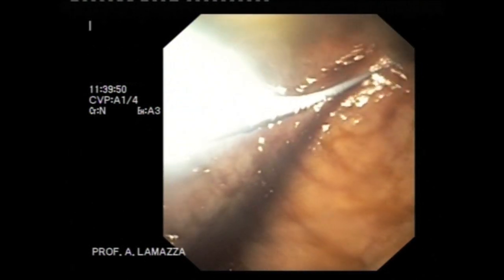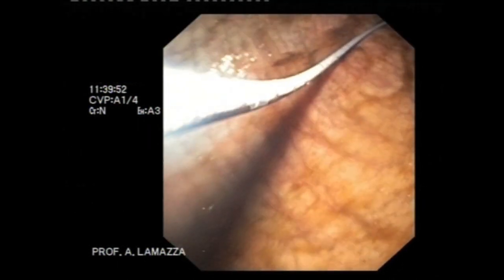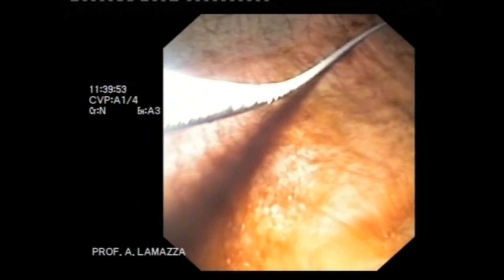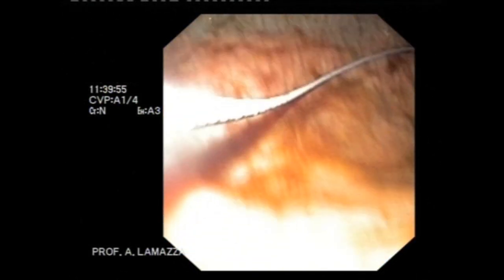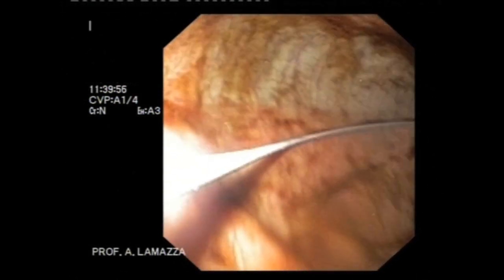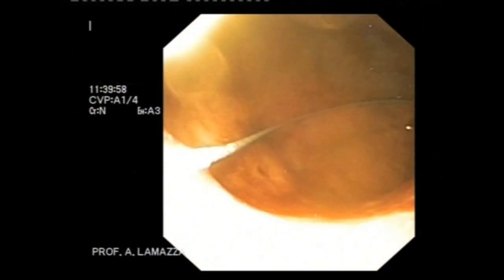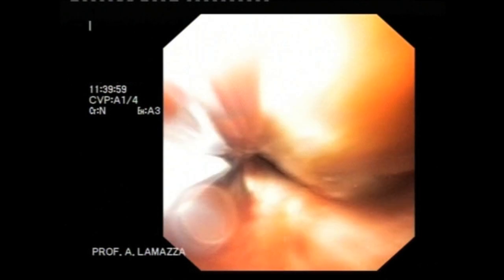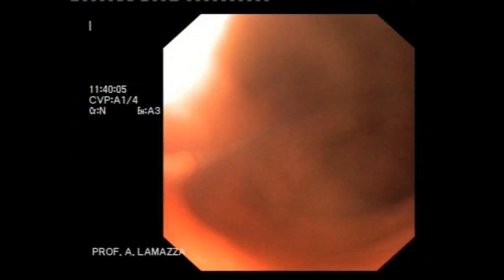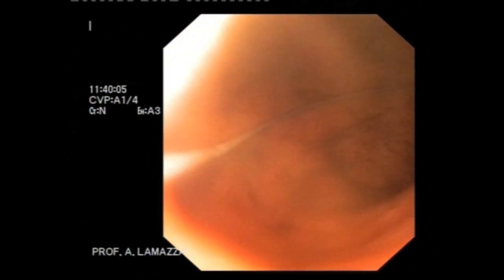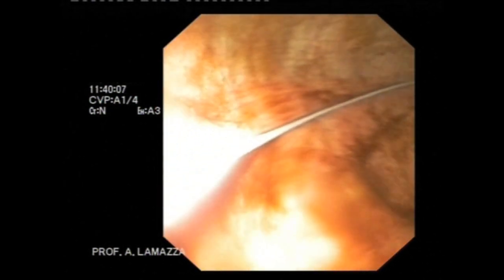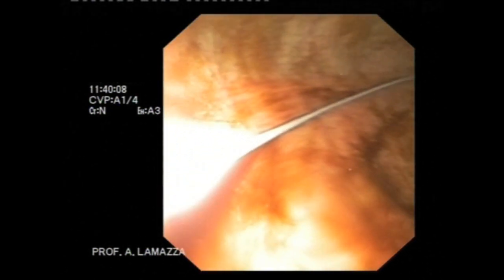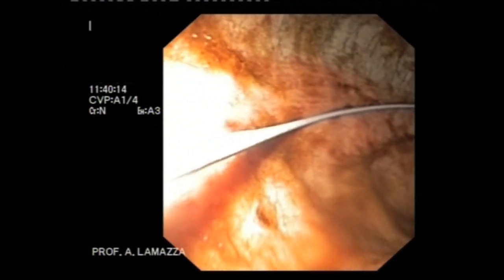The correct position of the guide wire is confirmed fluoroscopically. The pediatric nasogastroscope is then removed while measuring the length of the stenosis. This measurement will help to choose a stent with adequate length. The guide wire is left in place.